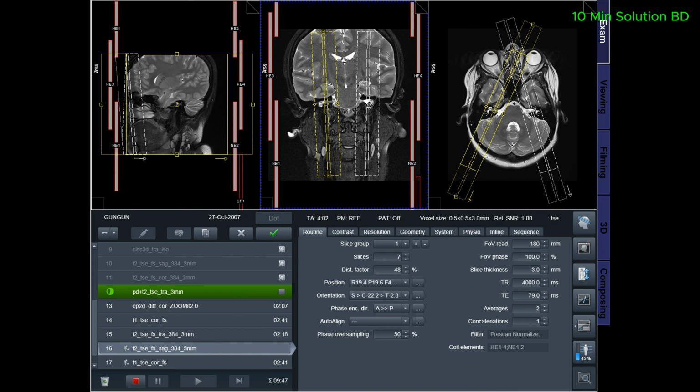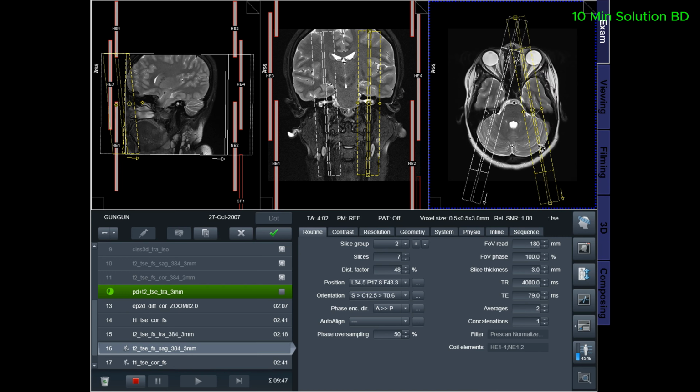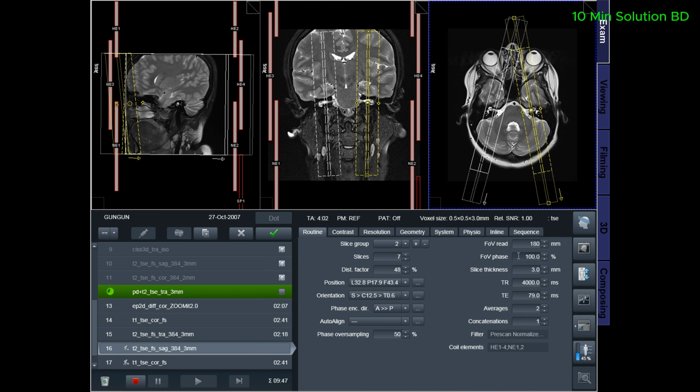Contraindications of internal auditory meatus MRI scan: any electrically, magnetically, or mechanically activated implant, for example, cardiac pacemaker, insulin pump, biostimulator, neurostimulator, cochlear implant, and hearing aids. Intracranial aneurysm clips, unless made of titanium.